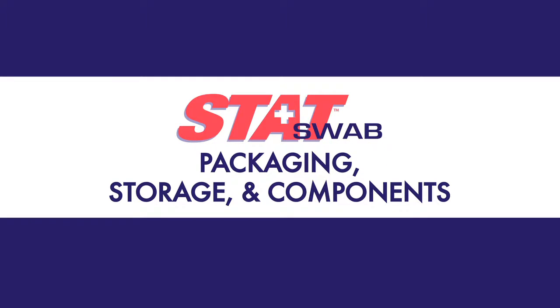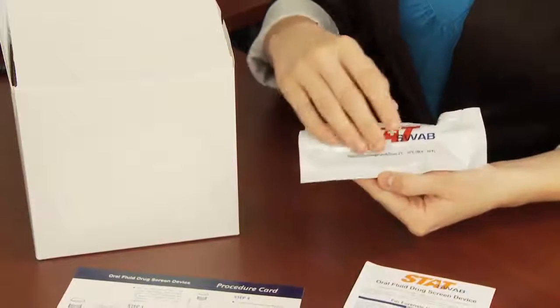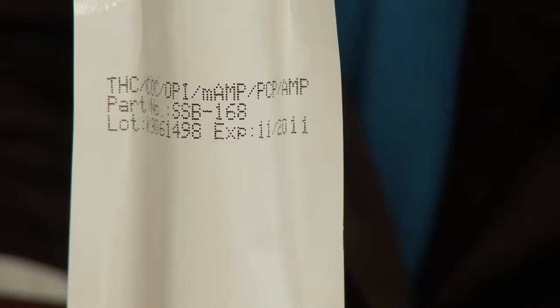StatSwab packaging, storage, and components. StatSwab tests are packaged in boxes of 25 and also include an instruction card and package insert. Each test is packaged in a sterile foil pouch and labeled with the product part number, the drugs and alcohol to be tested for, an expiration date, and a production lot number.